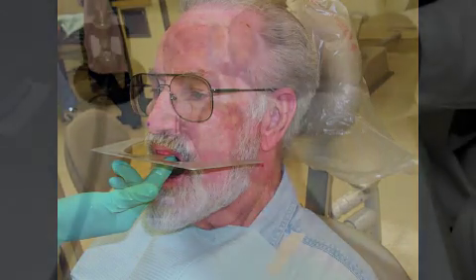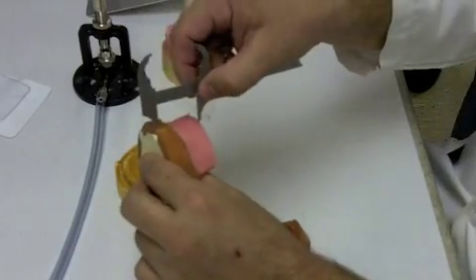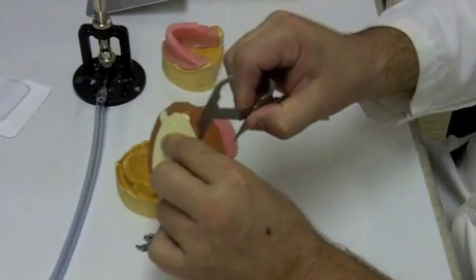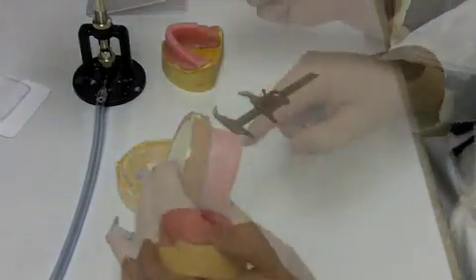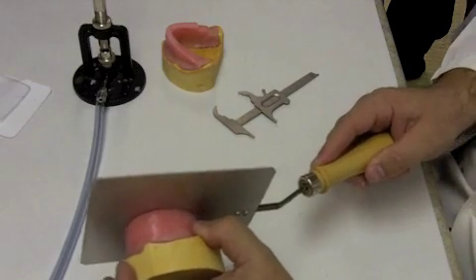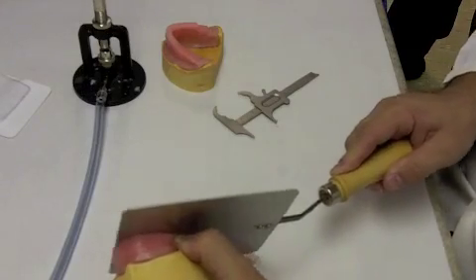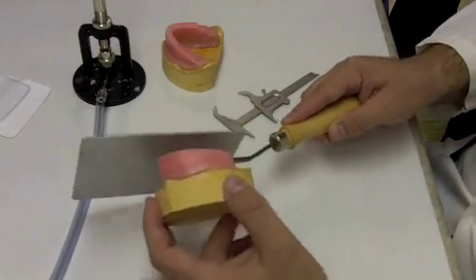For our typodont, again, it's 32 millimeters from the top of the typodont. So the easiest thing at this point is just to take your Boley gauge and carve it around at 32 millimeters. Now remember, this 32 millimeters is just an arbitrary number that we're using for the typodont. This has nothing to do with a live patient. So we mark that at 32 millimeters. Then you're going to take a hot instrument. Here we're using a large spatula type of instrument, and it allows us to sear the entire surface down at once. We've made our mark at 32 millimeters, and we're going to take it down to that 32 millimeters.